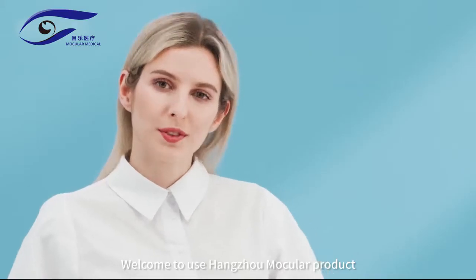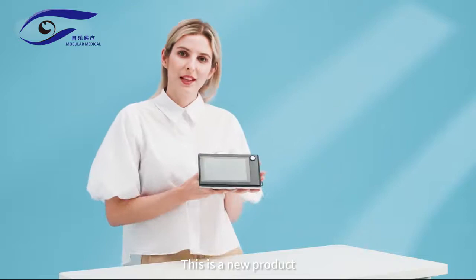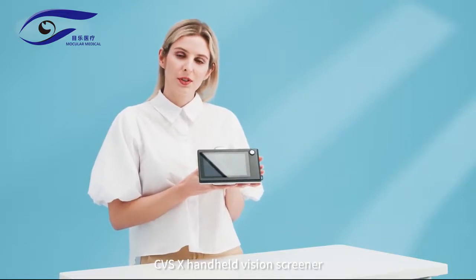Welcome to Hangzhou Mocular products. This is our new product, the CVS X Portable Vision Screener.